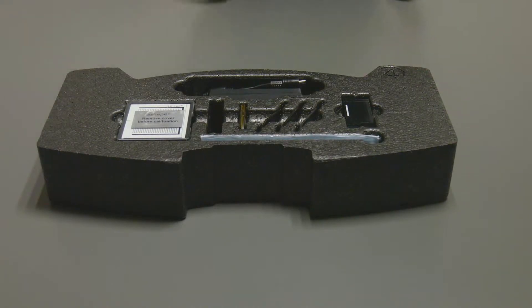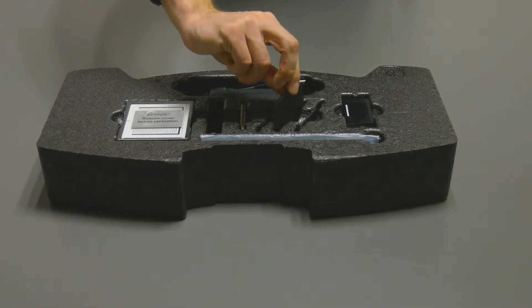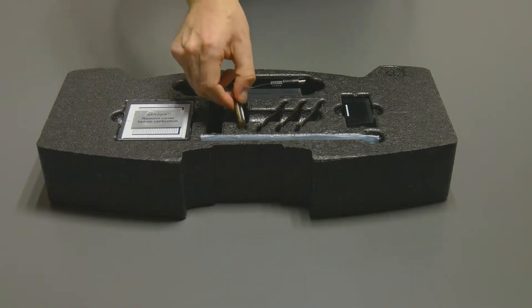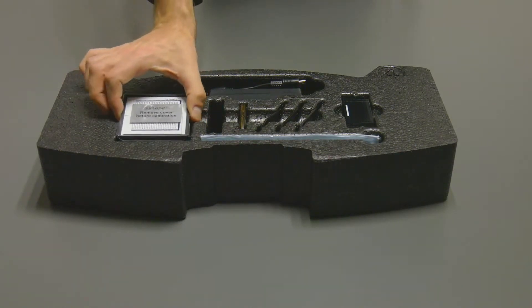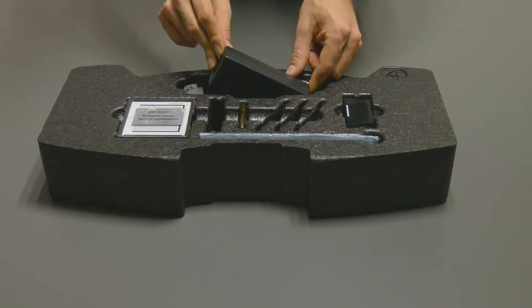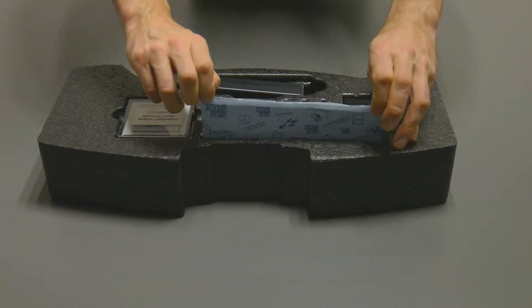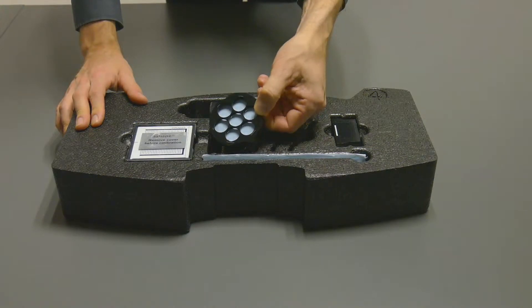The lowest insert contains a scan height adapter, interface plates, a license dongle, a calibration object, a power supply, and blu-tac. Optionally, for the E3 scanner, there is also a multi-die fixture included.